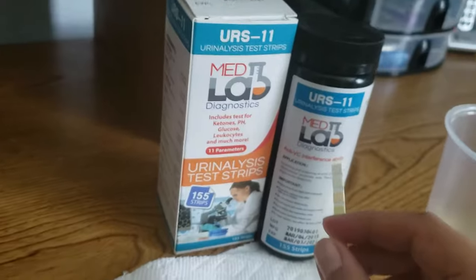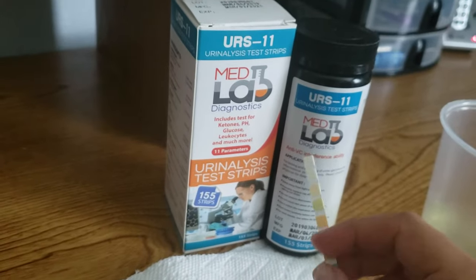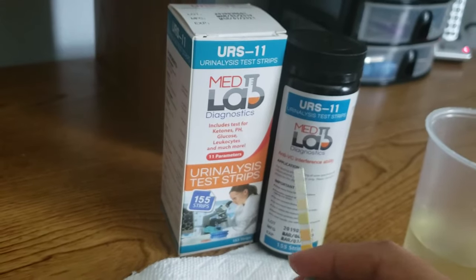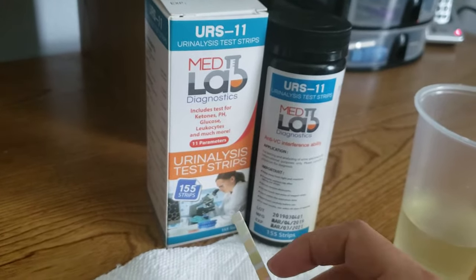These strips will generally last around 60 to 90 days once you open the seal, depending on how well you store them. They could even last a little bit longer if you keep them away from temperature and humidity and store them in a dry, cool place.